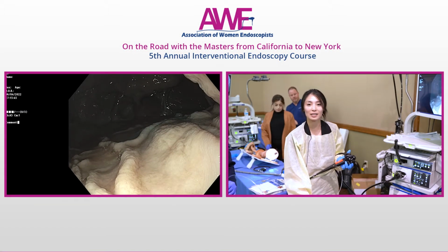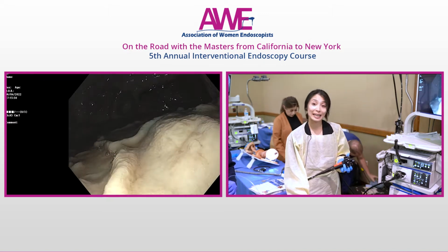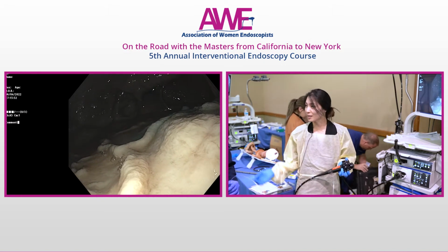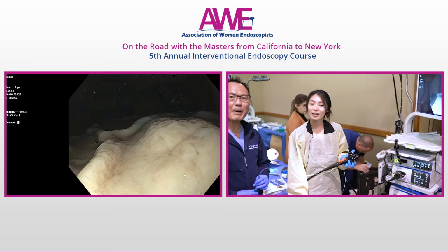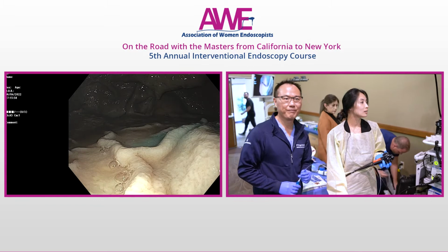I'm one of the Advanced Therapeutic Fellows at Johns Hopkins, and we'll be demonstrating an EMR case today, and I have with me Dr. Andrew Gatt. Yes, Andy Gatt. I work at Kaiser in Orange County. I'm also an advanced endoscopist as well.